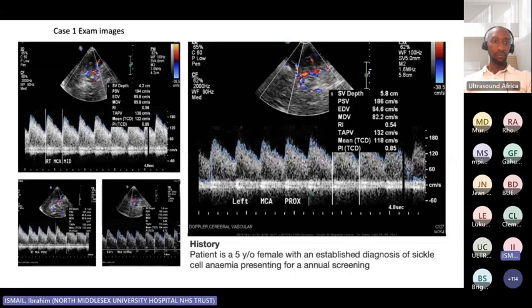So these are the three vessels you will always have to focus on as the core fundamental intracranial vessels that will give you the intended results. So middle cerebral artery, internal carotid artery, terminal point, and the anterior cerebral artery. That's what all the research was done on.